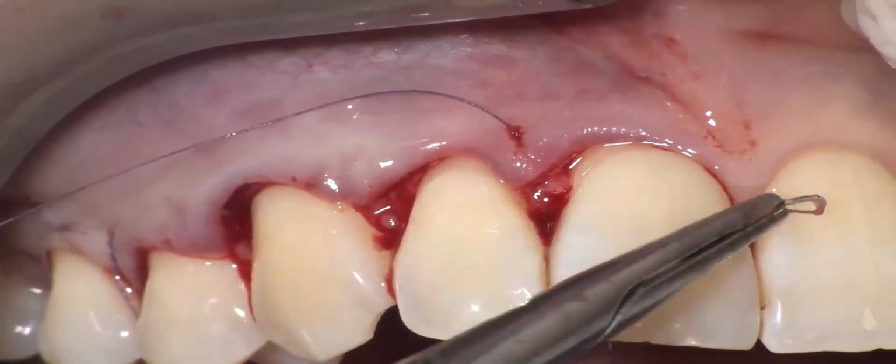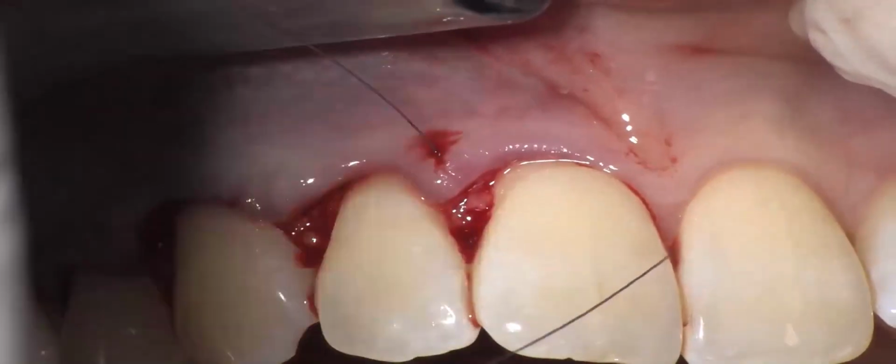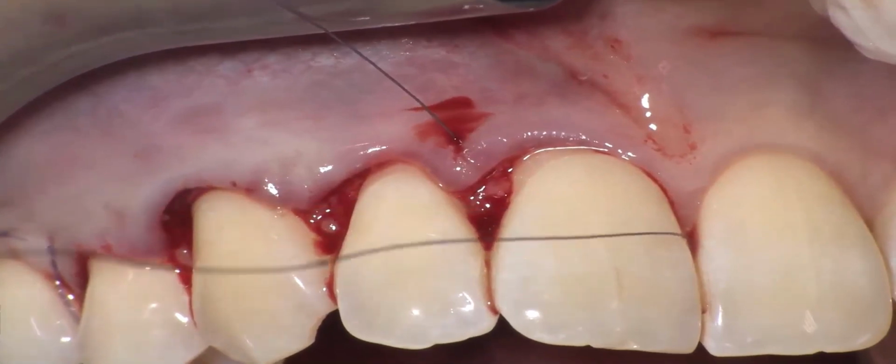Again, I give anchorage to the mesial papilla, which has not been elevated.